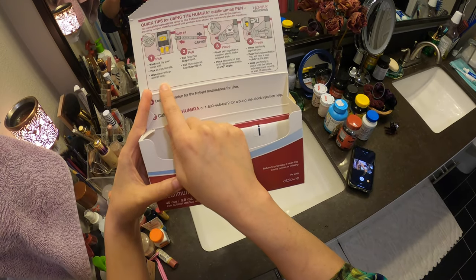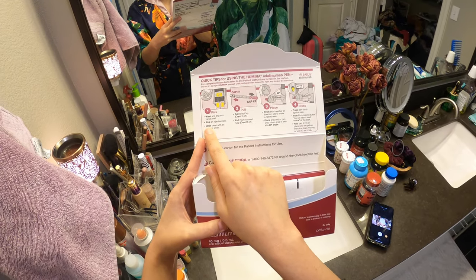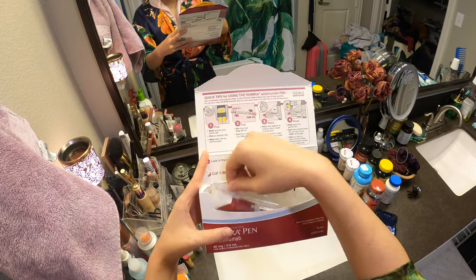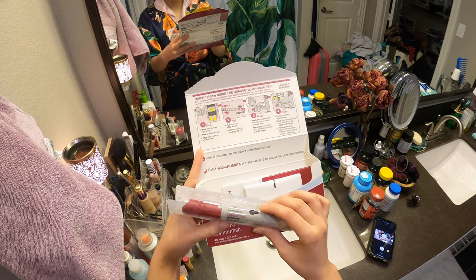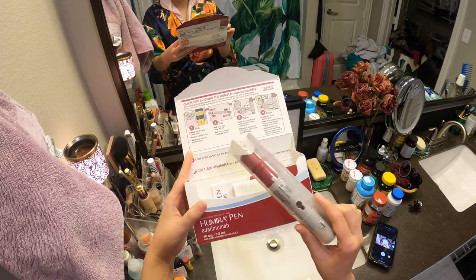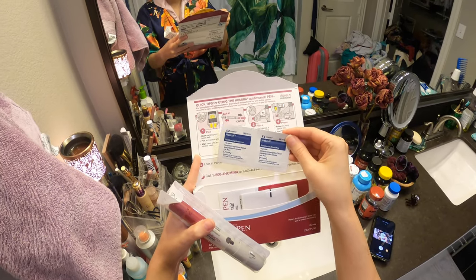So you open it up and you've got your quick instructions, just to remind you. It has two pens. I've left this out since this morning to let it come to room temperature, because that's supposed to make it less painful to inject, since this is the original formula that has citrate in it.